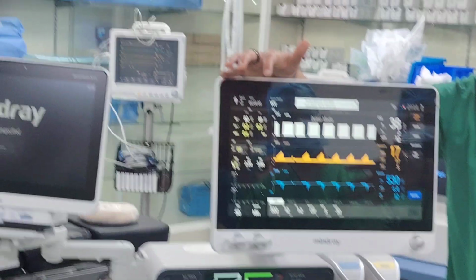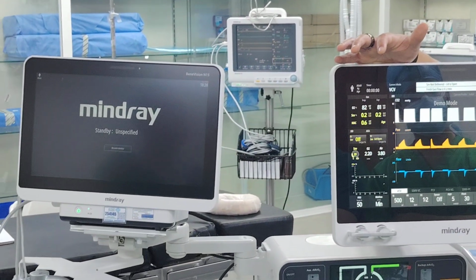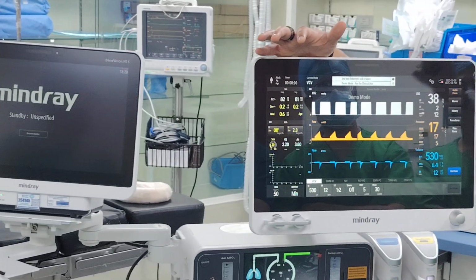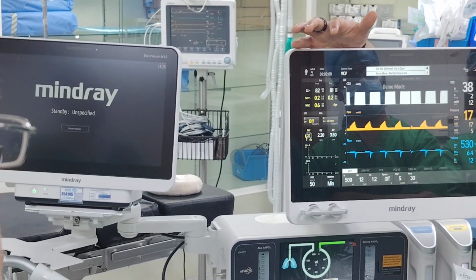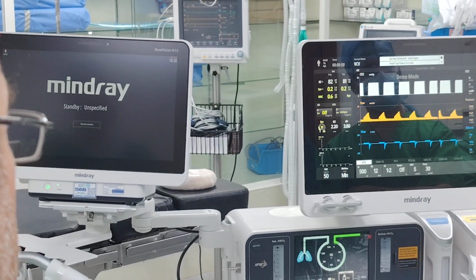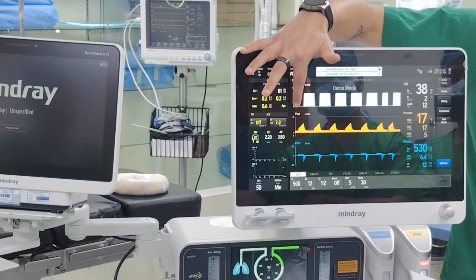Okay? Now the question will be, what are the settings of sevoflurane? You will not know. The machine will control everything, number one. Number two, what is equally important is how much is the total flow. This is the very important thing for you guys. You will look here. Oxygen plus air, you combine them, now it is around 6 liters. Okay? So you know, for example, today, if this is a real patient, 0.2 is very far from 2.